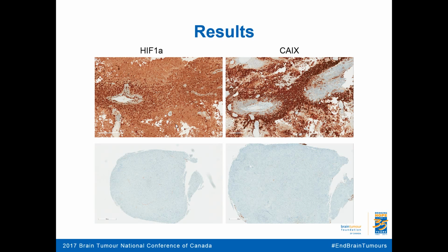You see there is a lot of staining with HIF1 alpha in the hypoxic one. Same as this one. This is CA9 or carbonic anhydrase isoenzyme 9. This is another cell marker that goes up with hypoxia, and this is the hypoxic sample, this is a hyperoxic sample. Same patient, you see there's tremendous difference in terms of what we see.